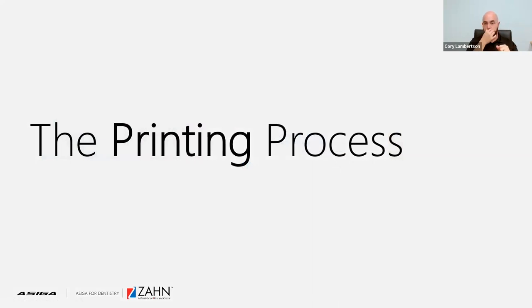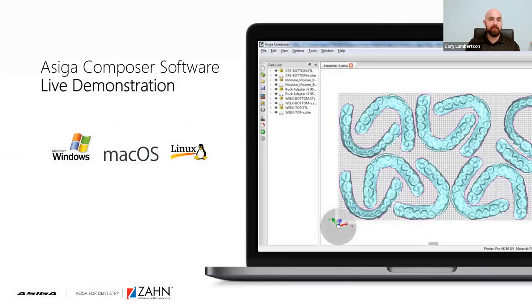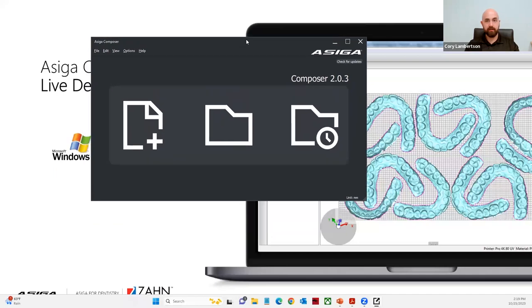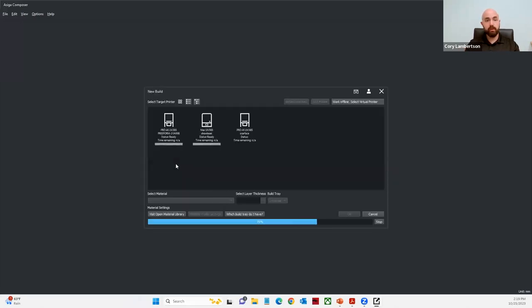Let's take a look at the printing process — this is where the fun begins, and we'll step away from the PowerPoint. We're going to show a live nesting technique for the denture teeth and denture bases. I'm going to go ahead and open up my Asiga Composer software. I believe it's loading on my second screen, so we'll pull it over here. I have my Asiga Composer software open, and the very first thing we need to do is create a new build. I'm running the latest version of Composer, version 2.0.3, in dark mode.